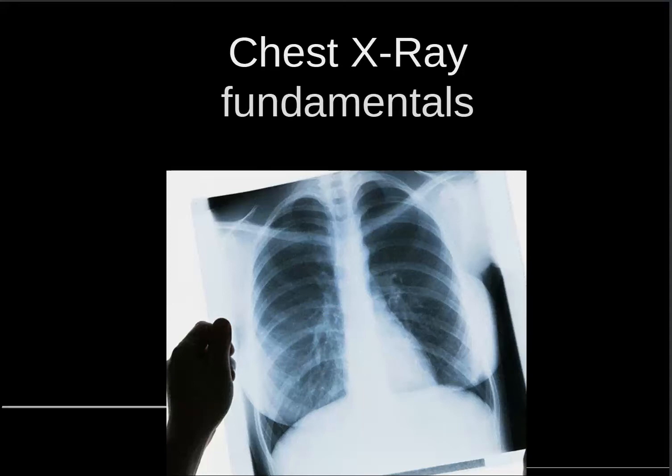I'm Dr. Pathak. In the next hour I'm going to be talking to you about the basics of interpreting a chest X-ray. I'll start with how the physics works. Essentially, a chest X-ray is an X-ray image.